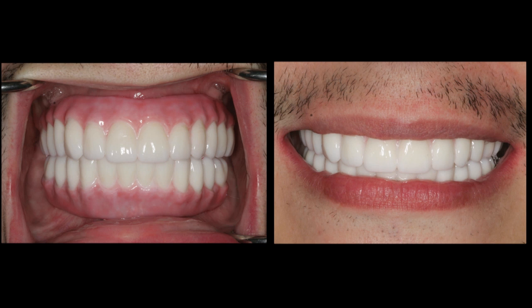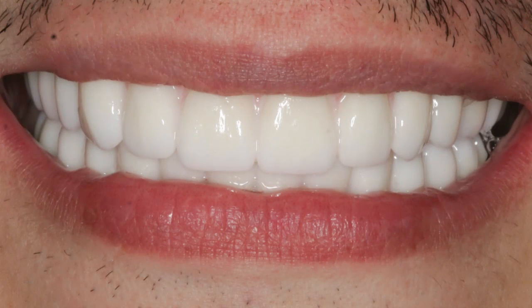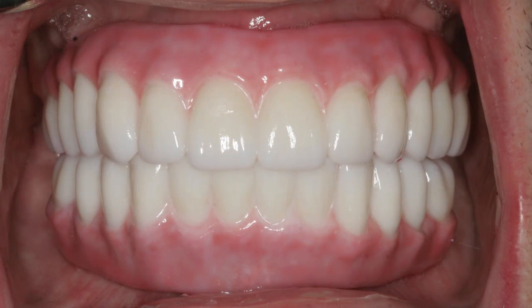Following completion of the healing phase, final impressions are taken, wax setups are tried in, and a final restoration is produced that adheres precisely to the patient's approved design. Both arches were restored with monolithic zirconia implant restorations, which suited the patient especially well given the extended length of time he would need this prosthesis. This patient was young, and we expect many decades of function from these prostheses.